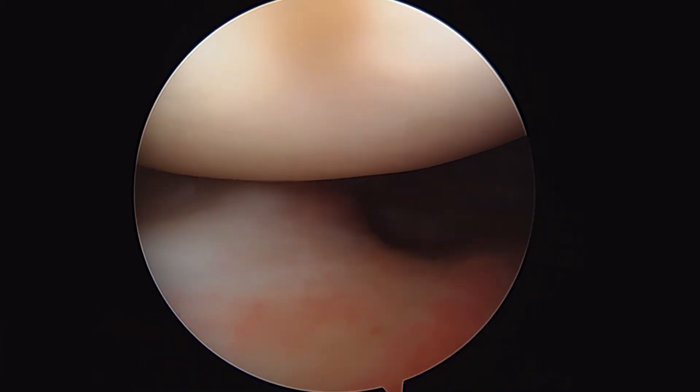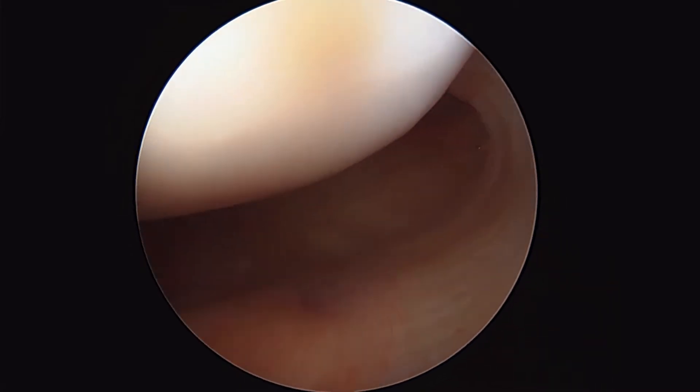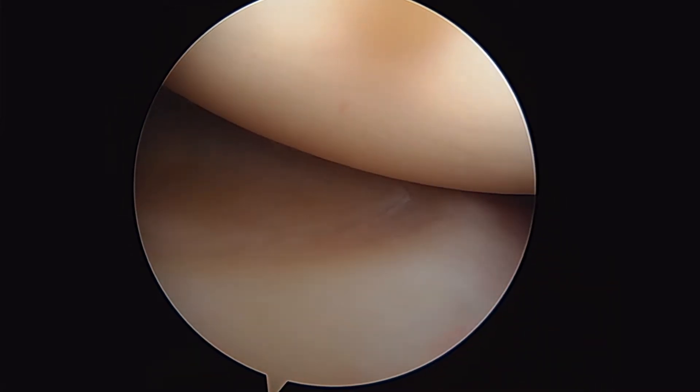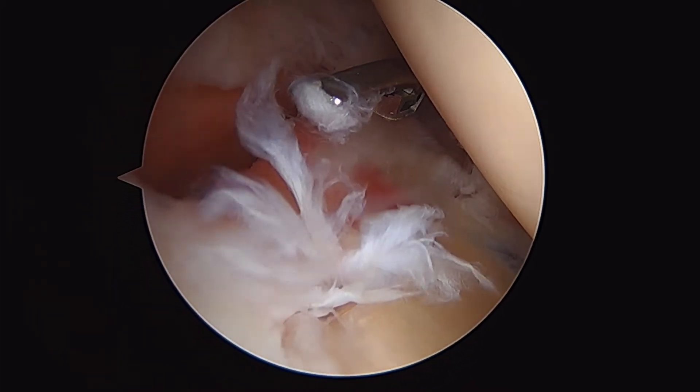If we flip our eyes to look inferiorly, that's the wave sign, the inferior glenohumeral ligament, and then there's the inferior labrum right there. As we come around the back, you can see the posterior labrum, and then we're getting up here into the superior labrum.